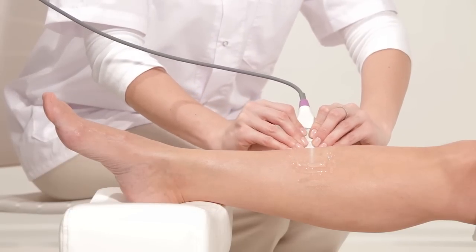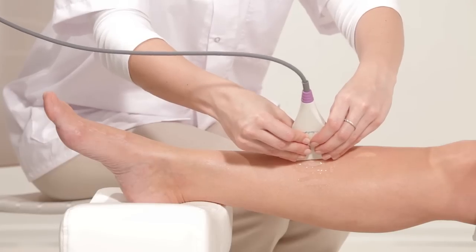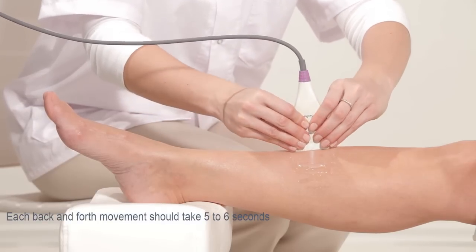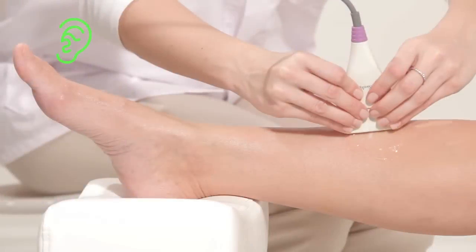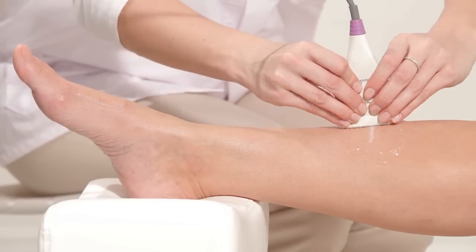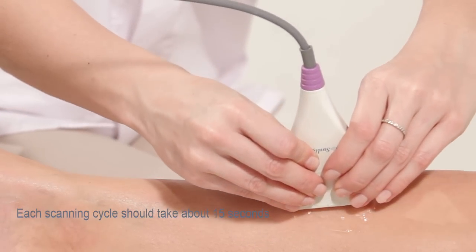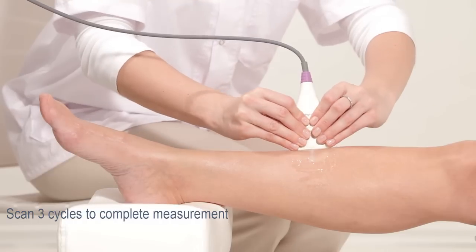Begin measuring the bone on its flat surface and move the probe backward and forward 3 to 4 cm in each direction. Each back and forth movement should take 5 to 6 seconds. A beeping sound confirms that you are measuring correctly. Each scanning cycle should take about 15 seconds. Scan 3 cycles to complete the measurement.